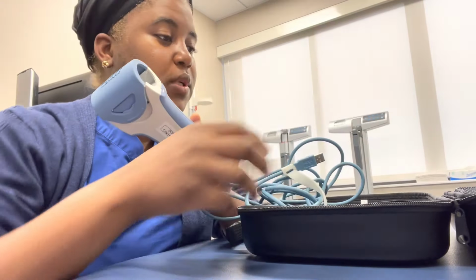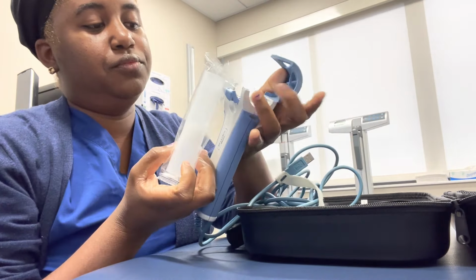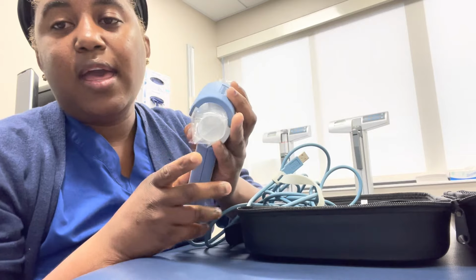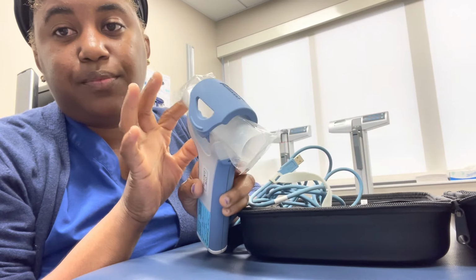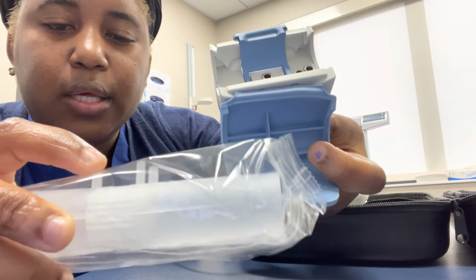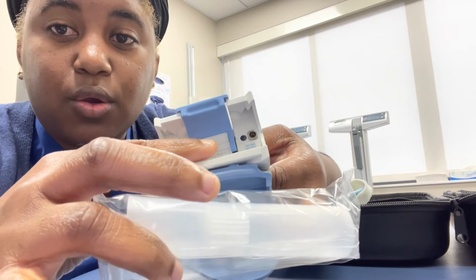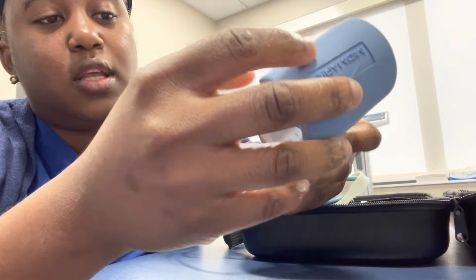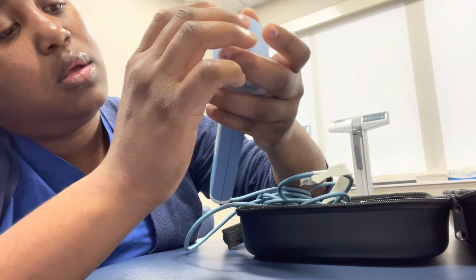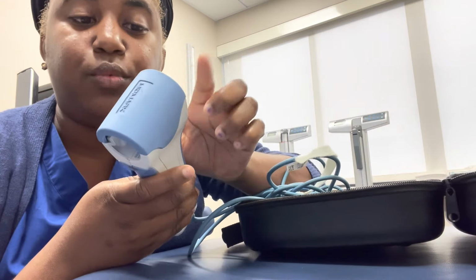So this is what it looks like, and this is what you put in here like this, and then you close it, and then the patient blows through here. These three little, I'm not sure what they're called, are supposed to line up with these three holes right here. And then you close it like this. And then the opening is where the patient will blow.